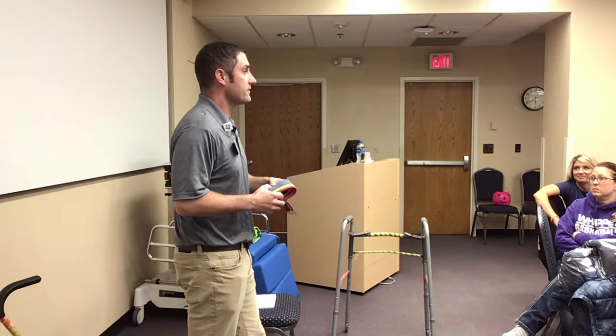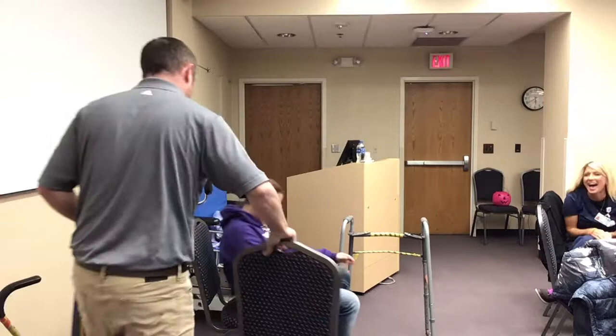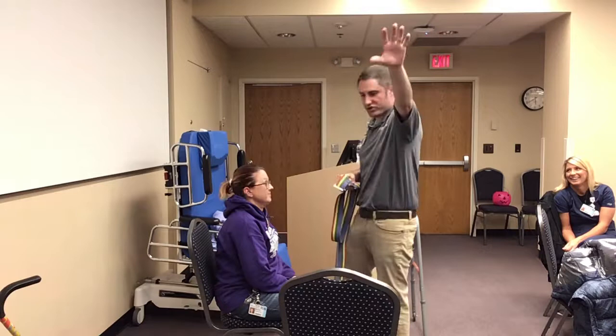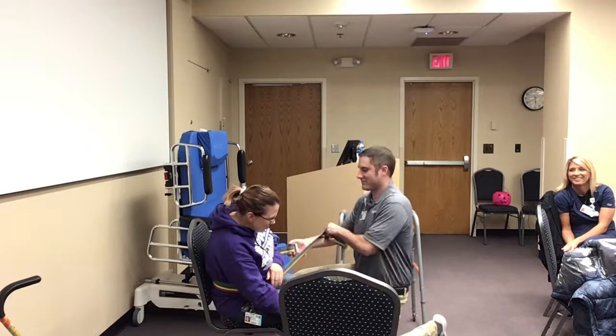I'm going to demonstrate a transfer. Michelle's sitting on the edge of the bed, and here is the recliner. We got the room set up — we've got the telemetry monitor up here. This is exactly what we want, except that Michelle had a stroke and she's very weak on her right side. So I'm going to put this gait belt around her.